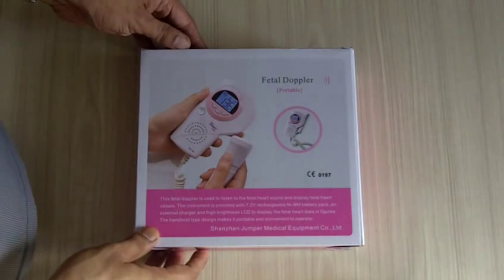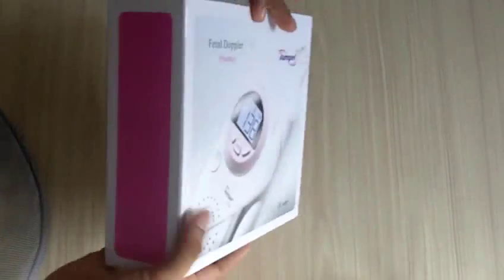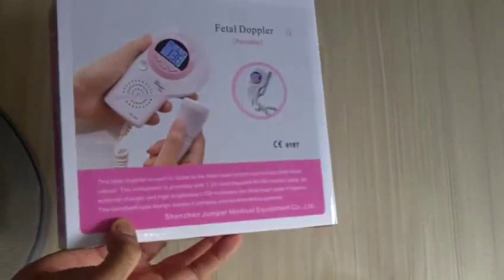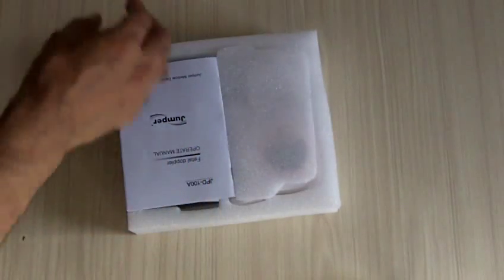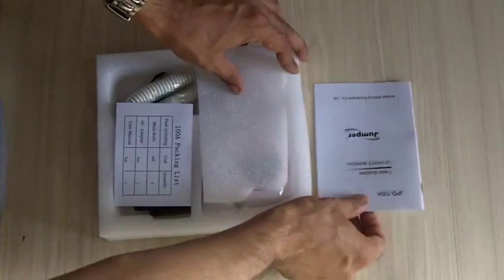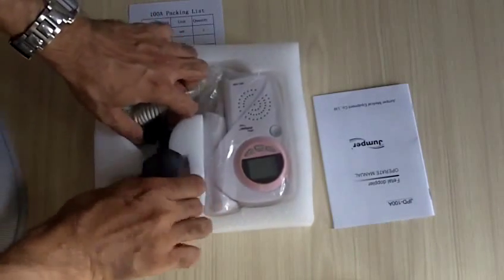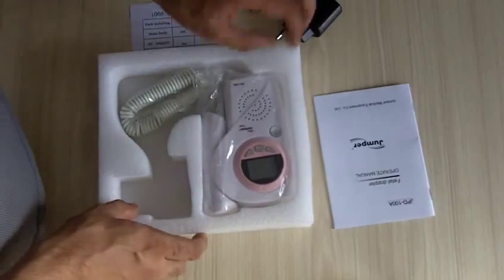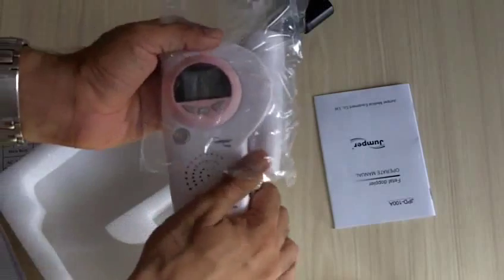This is the video for the JPD 100A fetal Doppler. It comes in this kind of pack — you just open it like this. The packing list typically includes one operator's manual, one charger, and of course the JPD 100A fetal Doppler.